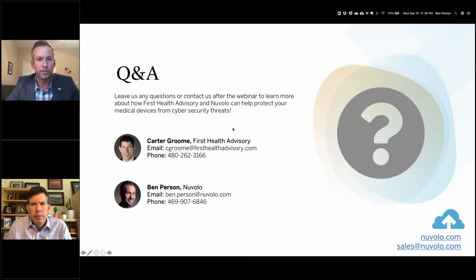Great, Barbara, good question. What attributes do you use to match assets found in Discovery to those existing in the CMMS? So Barbara, we use a number of measures. We look at the MAC address, we look at the device name itself, we look at serial number, we look at IP address. There's about 5 other measures we're looking at.